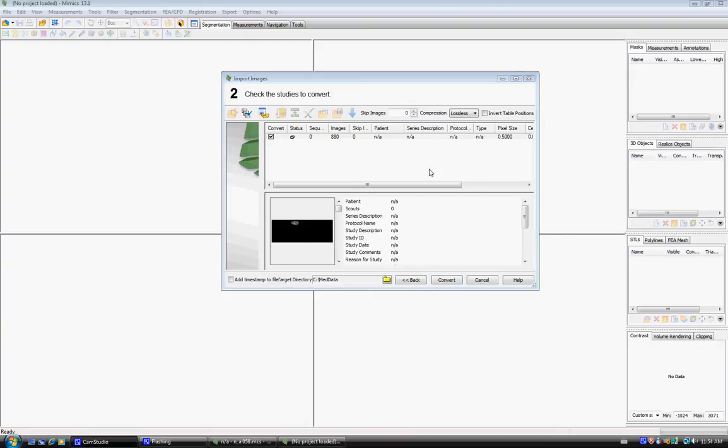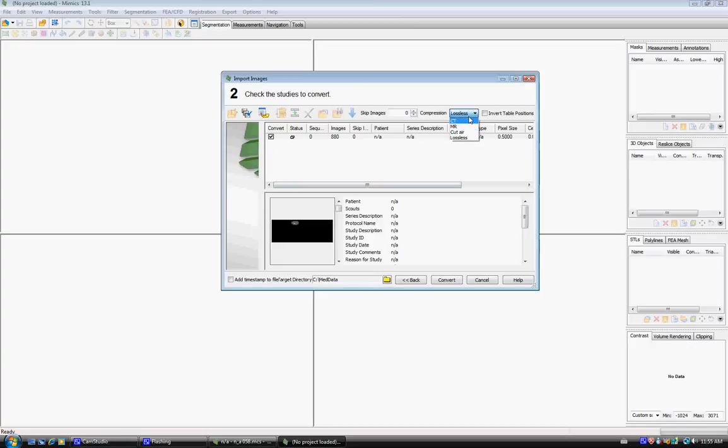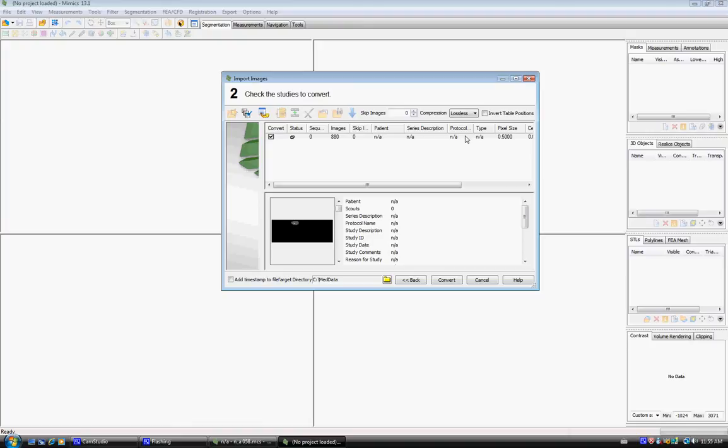This is the final screen before converting the images into Mimics, where you're given the option of compression. Compression covers which bit you're working in. CT is usually 12-bit. Lossless is for a 16-bit image that you want to keep at 16-bit. It doesn't really matter for this scan because it's a CT anyway, so lossless and CT will be the same. After this, click Convert.